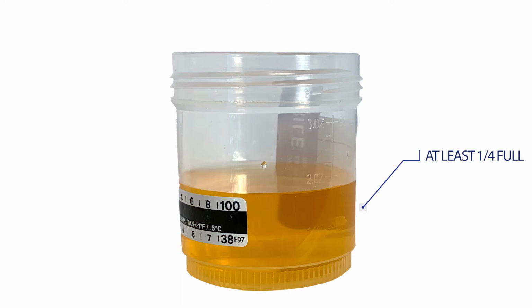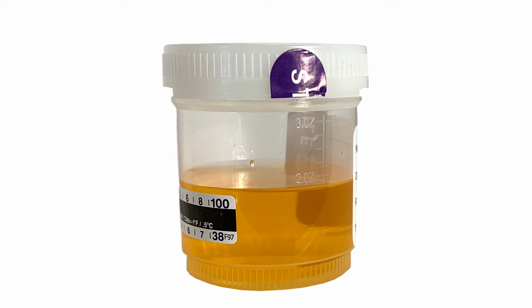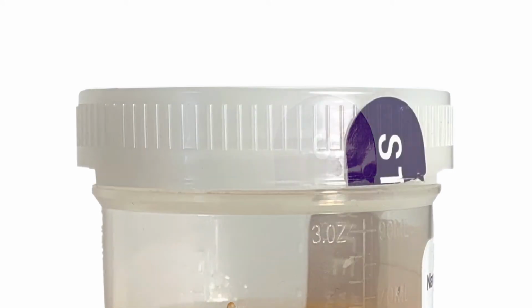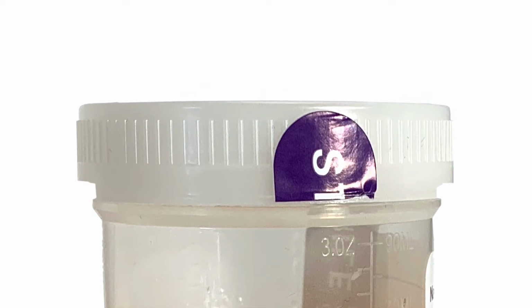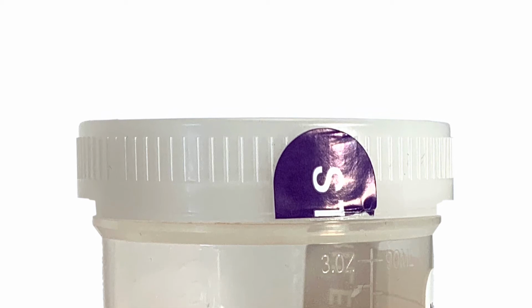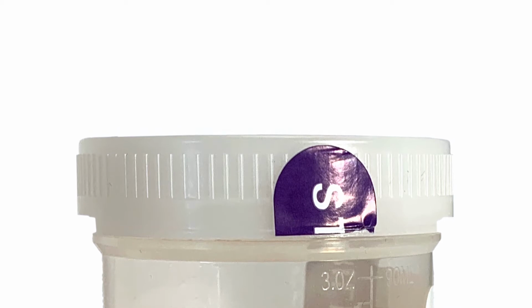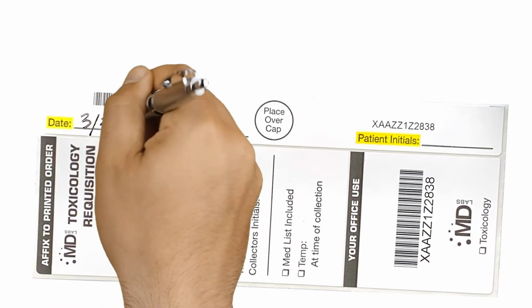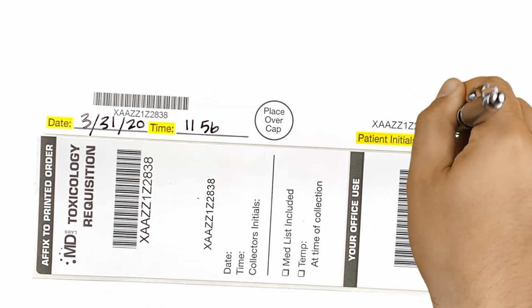If there is enough urine in the cup, make sure the lid is screwed down tightly before affixing the label over the lid. Turn the lid clockwise until you hear a click. It is common for patients to not tighten the specimen cup lids appropriately, which can result in untestable samples and damaged paperwork. Once the lid is securely tightened, write the collection date and time using a 24-hour format, along with the patient's initials on the chain of custody label.